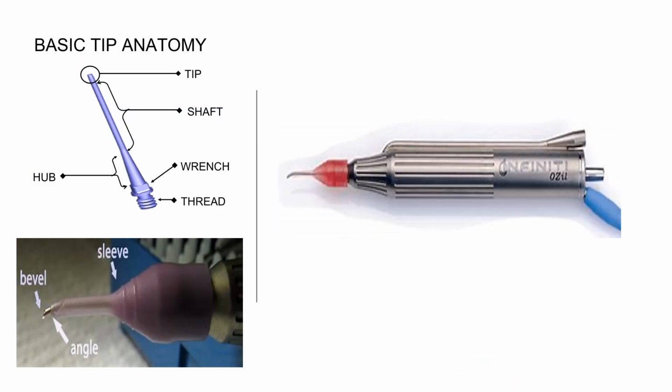So let us now talk of the phaco tip and the sleeves. As the picture suggests, both tips and sleeves are an integral part of the phaco handpiece, without which the phaco cannot happen. The phaco tip is firmly attached to the handpiece through a device called a wrench.